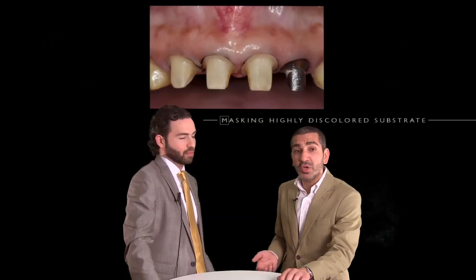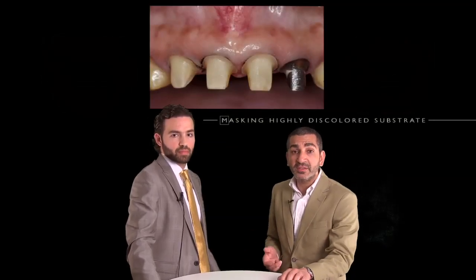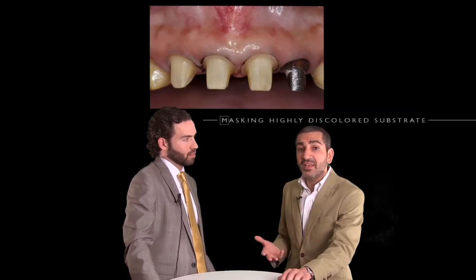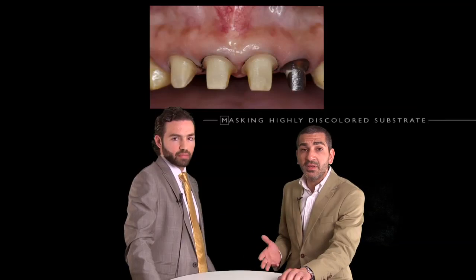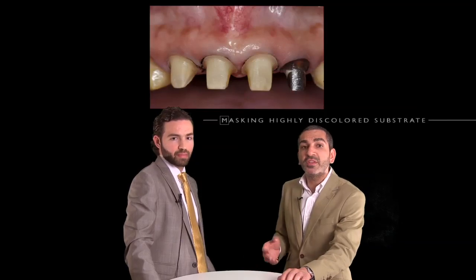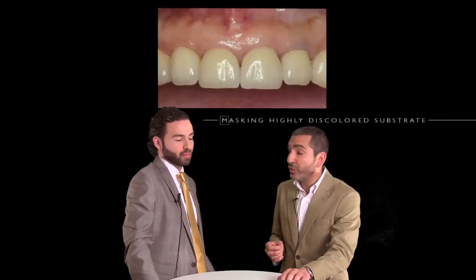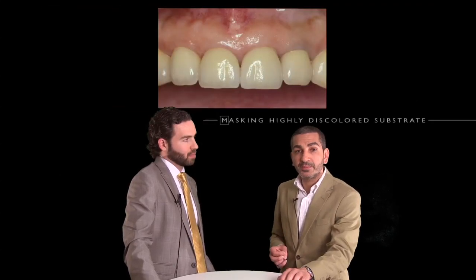How about in this situation? We got multiple substrates, different colors. And how are we going to manage this case? Again, PFM, it's simple, it's easy. So please do not discount porcelain fused to metal crowns just yet. It's a fantastic tool in restorative dentistry.